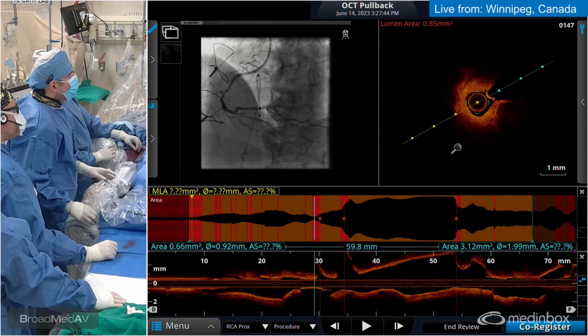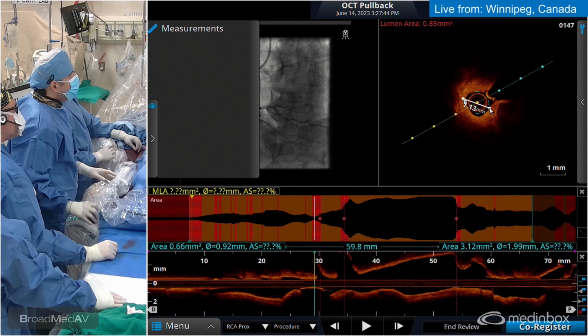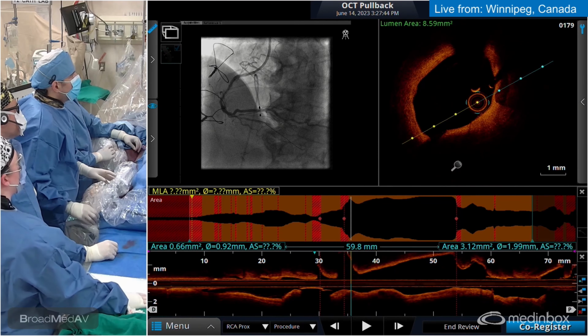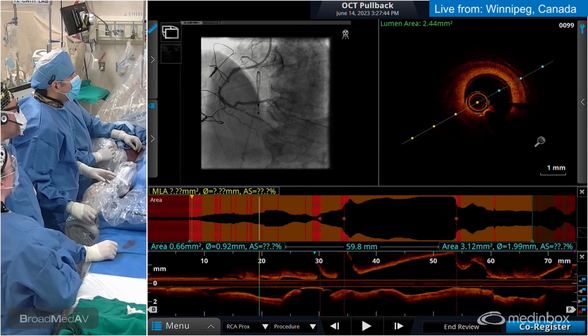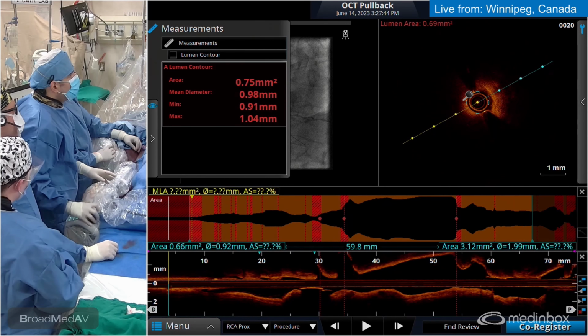The inner lumen diameter, even though we've ablated, is only 1.13. Tells you that there's still room to go. The vessel itself is big. If we really wanted to, we can probably safely do 120 kRPM, but it's more than 3 for sure. But let's take the OCT out.